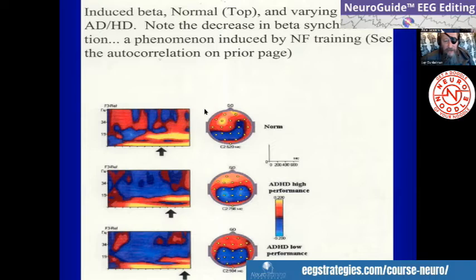And this is a joint time frequency analysis, JTFA, from 0 to 74 cycles a second, and from time 0 to 1,100 milliseconds later. So this is a second worth of data with a brief base period just before it starts. They were given a signal that tells them they had to hit the button.